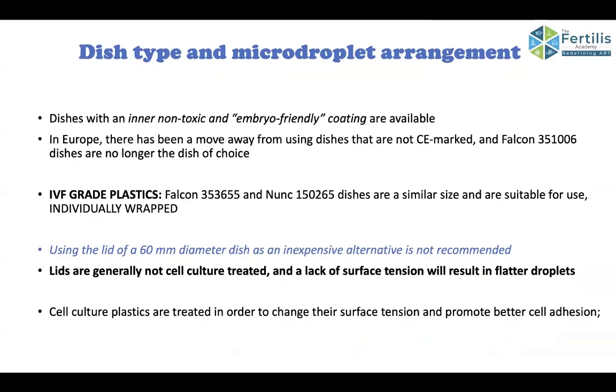So dishes with an inner non-toxic and embryo-friendly coating are available. You should always talk to the manufacturers, talk to the salespeople about how the dishes are designed, and only then start buying and using them. A very commonly used dish such as the Falcon 1006 dish is not CE marked and it should not be used, whereas most people will do a pickup in this dish.